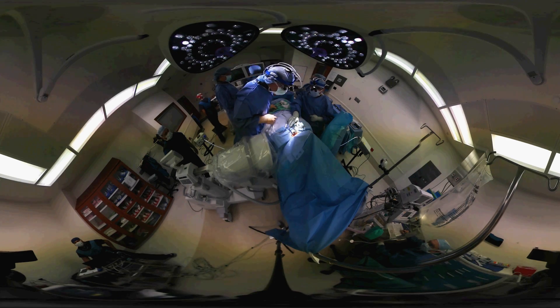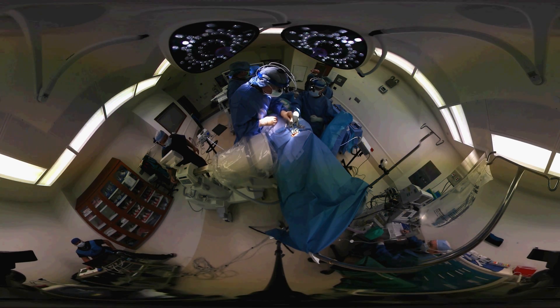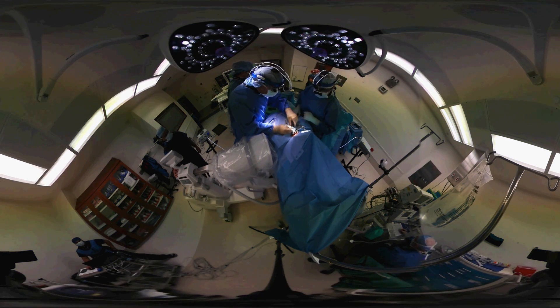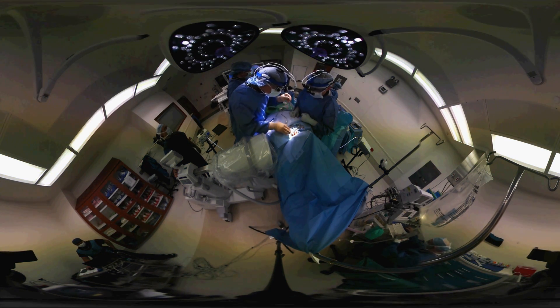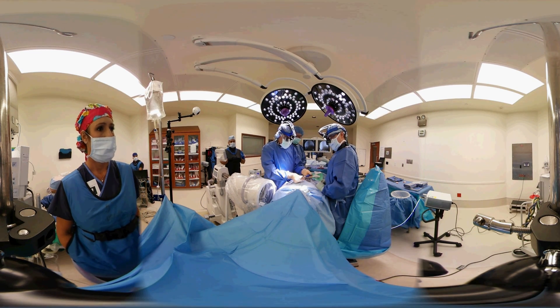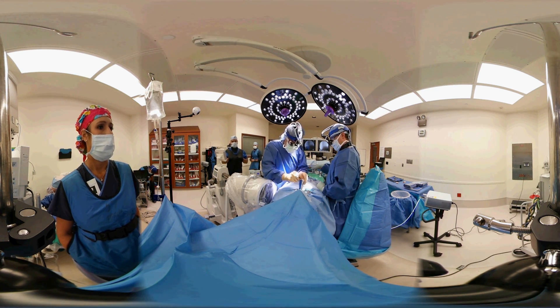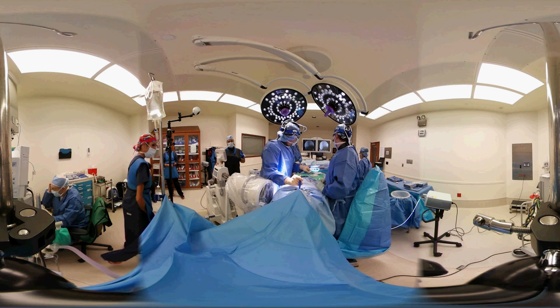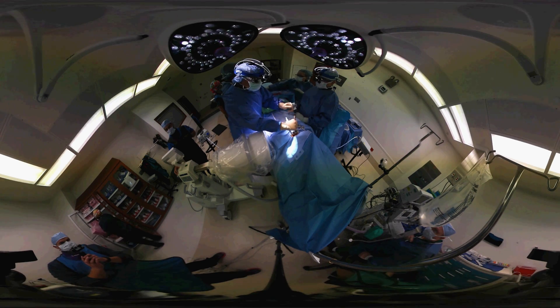Here we can see that I'm trialing different size implants. For each size implant we have a trial, so I'm going through the trial and checking to make sure it has the right size. We want to put the largest size artificial disc in for several reasons. Number one, it allows us to center the disc from side to side on the AP x-ray — the frontal view. And secondly, it allows us to have better end plate or vertebral body coverage so that there is no subsidence, meaning we want to prevent the artificial disc from sinking into the bone.